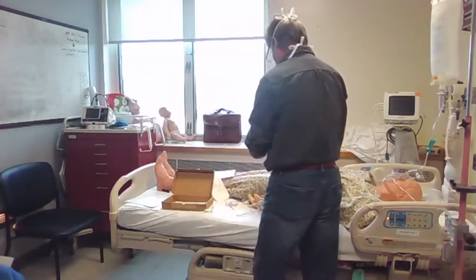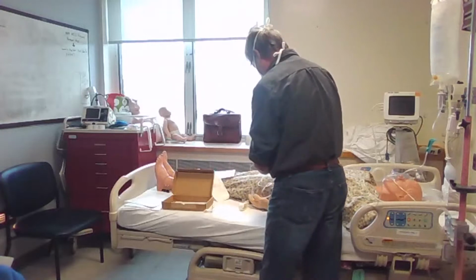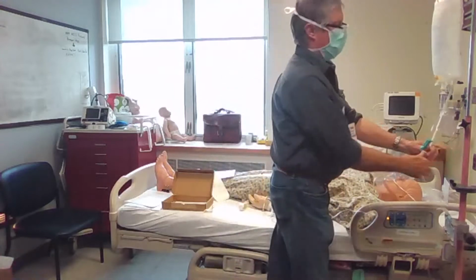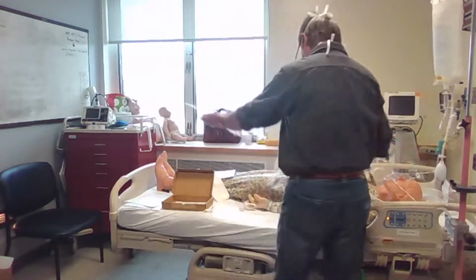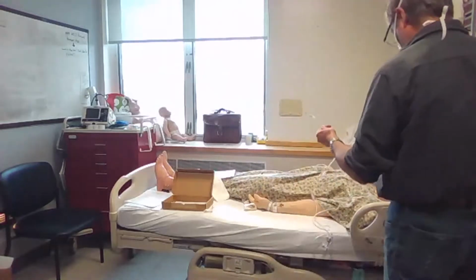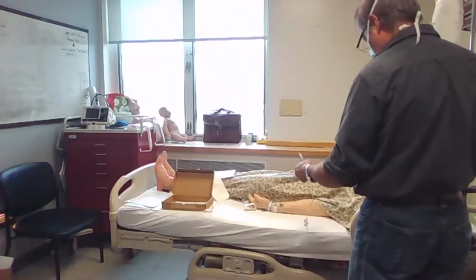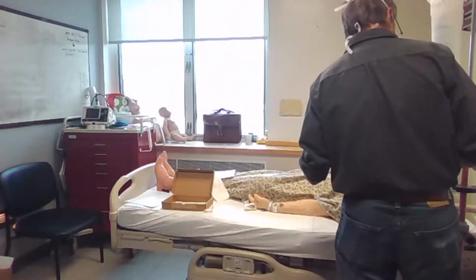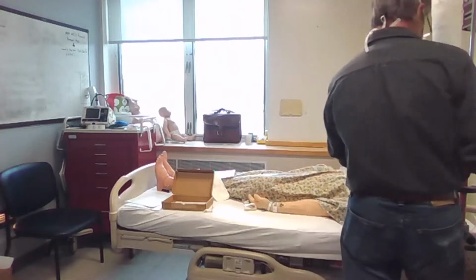So back to, I'm gonna put them back on where they were. They let air out of the three-way stopcock, which is here, and into the tubing. So we increase the flow a little bit. I grab the end of my tubing so that I've got control of it all. You hold it, and let the stopcock go. I'm just gonna push the air out. Clear enough now. Oh, it's really good.